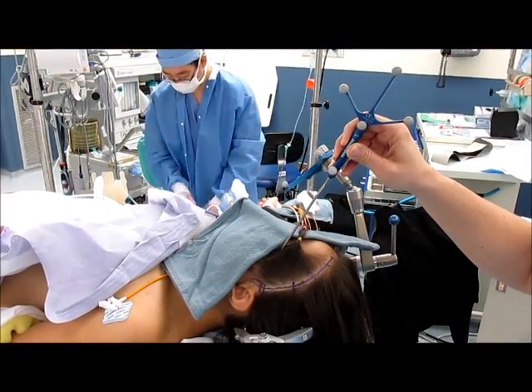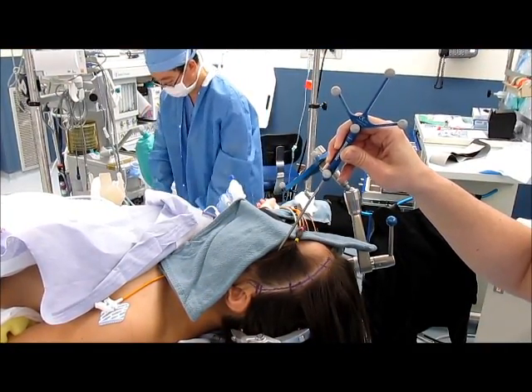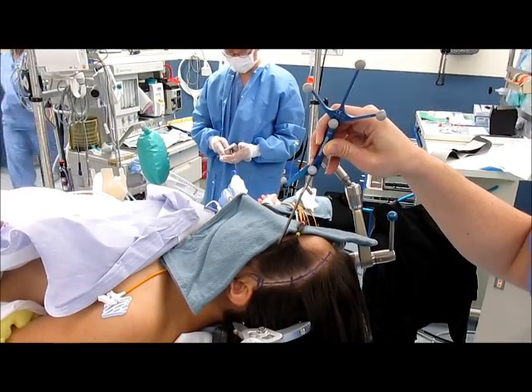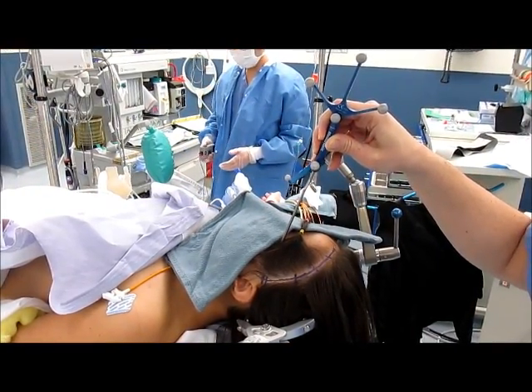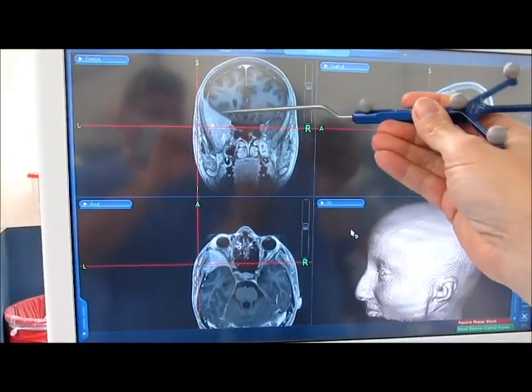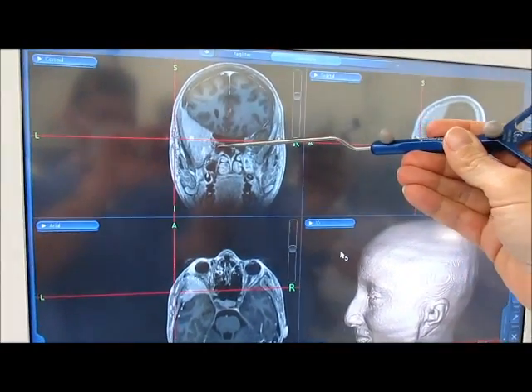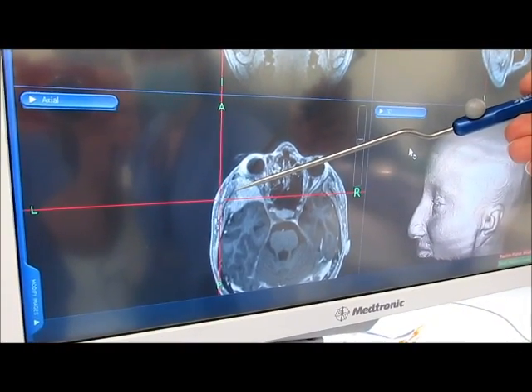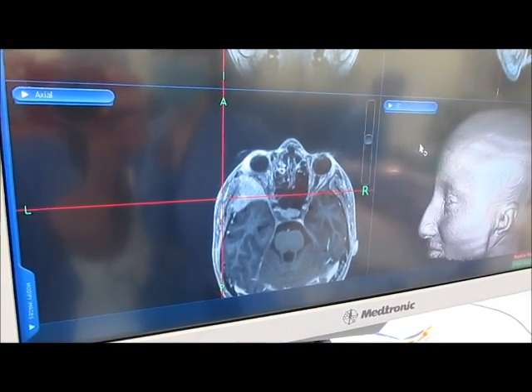Additionally, it's nice to use stealth for left sphenoid wing lesions in order to plan not only the proper incision, but to plan where to biopsy. If you look on the screen over here to the left, you can see that this is the area of bony involvement of the sphenoid wing. Using the stealth to localize where you should actually make your biopsy helps to plan your incision and the biopsy area appropriately.